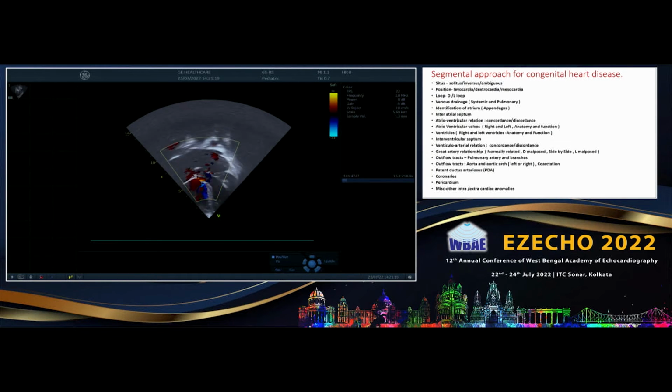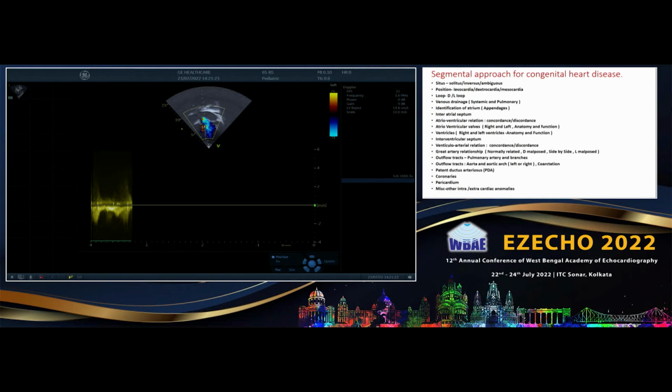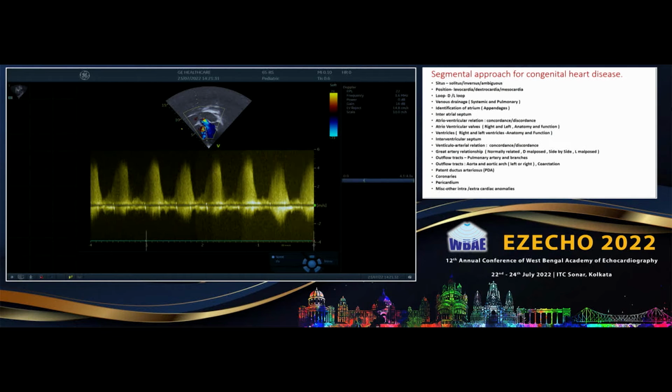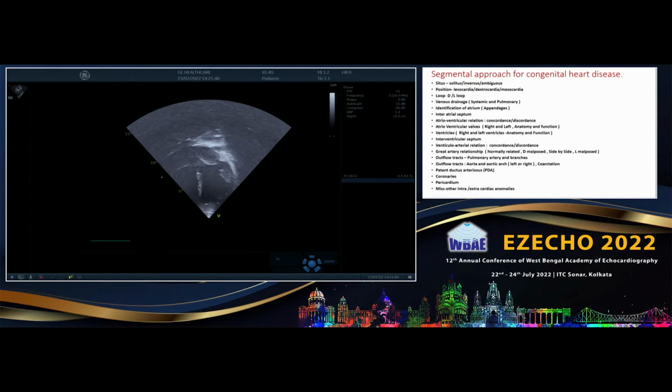So this child is showing dilatation of the left heart, and we can appreciate there is a flow coming just in the region of the aortic valve leaflet where it is getting connected to the tricuspid. There is some flow which is systolic in nature. If we had ECG, we could have shown. And it is showing a high gradient. If you can demonstrate that, yes.